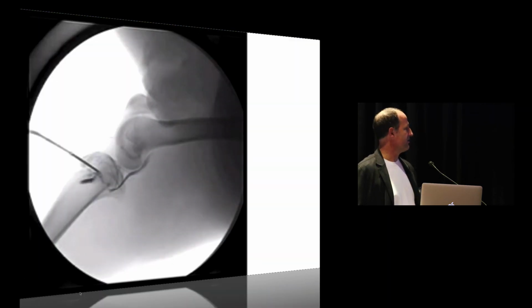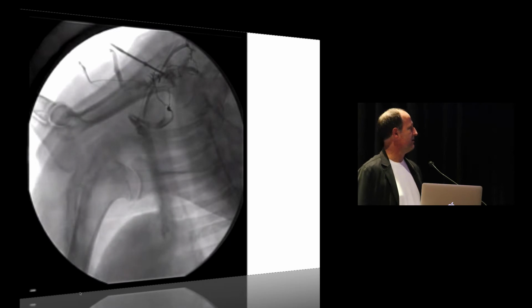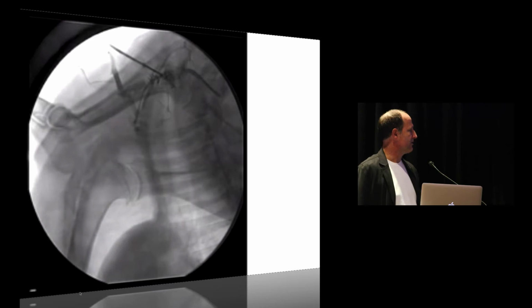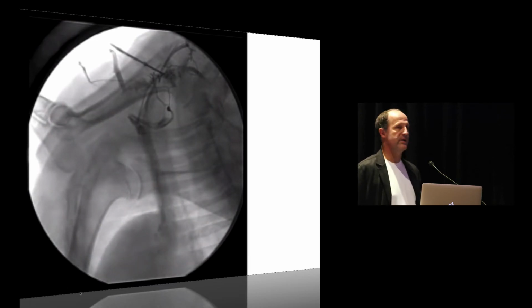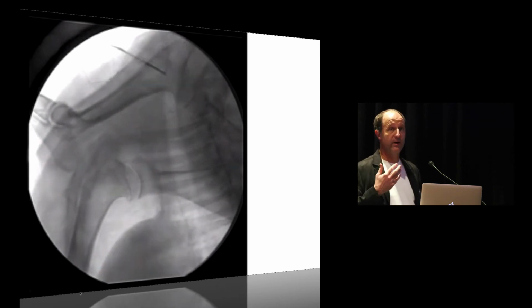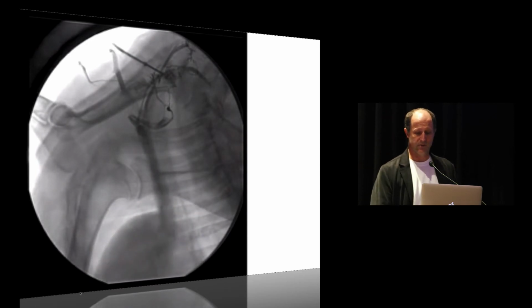Now, see, here they're doing some injections, and you see how quickly it just gets right into the venous system. And here's a humeral injection, and there's the heart down there at the bottom. So you can see that it quickly gets into the venous system and is very effective. So in an emergency, that'd be a great way. You can see how quick they are. It's a very efficient way to get a case going.